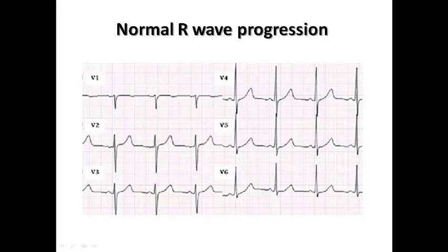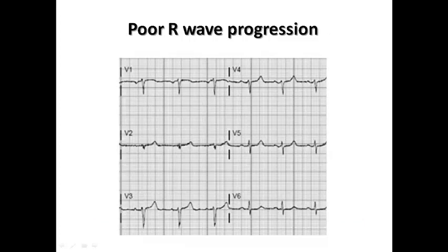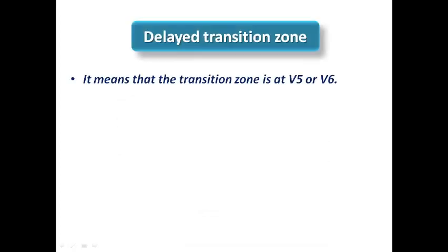In V1, V2, and V3 the R-S ratio is still less than 1, but in V4 the R-wave becomes taller than the S-wave, so the transition zone here is at V4 — this is normal R-wave progression. And here is another example of poor R-wave progression in which the transition is delayed until V6, as the first lead where the R-wave is more than or equal to the S-wave is V6.